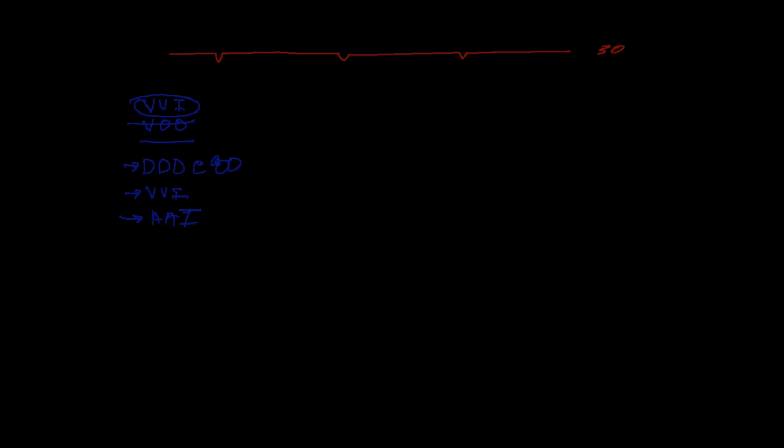And so that's what I would recommend. In this case, what you want to do is not really think so much about whether the patient does okay at 55, 60. You want to go for something pretty darn fast, so you just absolutely know whether you're taking over the pacing on this heart or not. I usually go like 80 or 90. I mean, these are desperate situations.